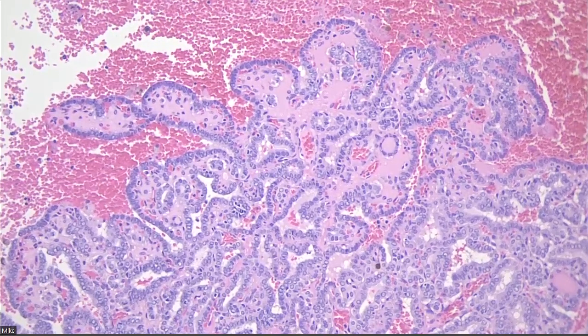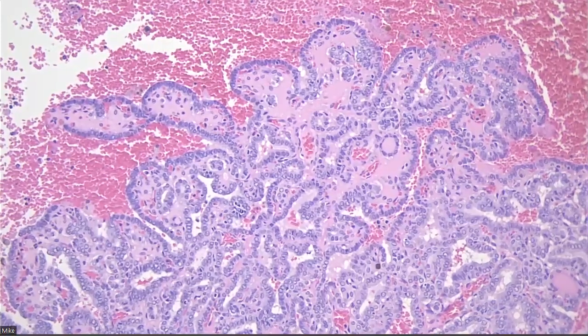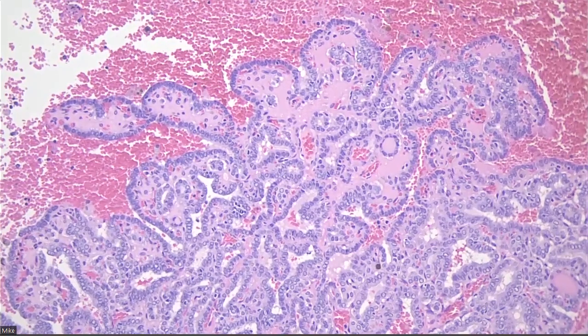Like, it's really important to have this, but we're so used to doing it for heme and for sarcomas, and we're not used to doing it for thyroid, because chances are this is not a high grade cancer and this person's gonna do fine, right? People don't care because the prognostics aren't that severely different. The prognostics for these low risk neoplasms are generally all still good. I'll show you some when we start to get bad.